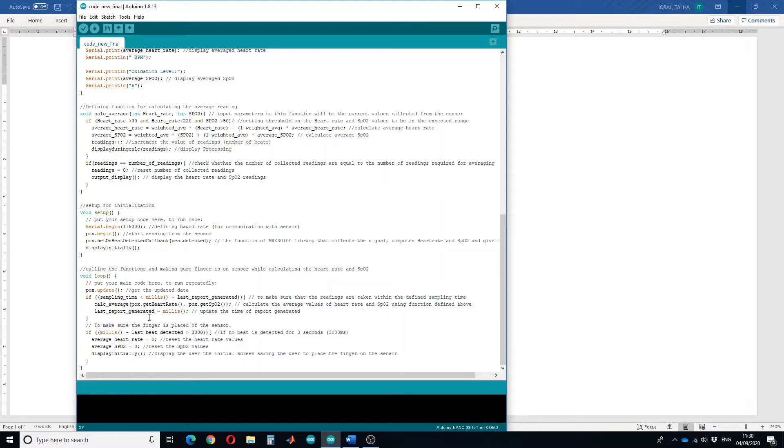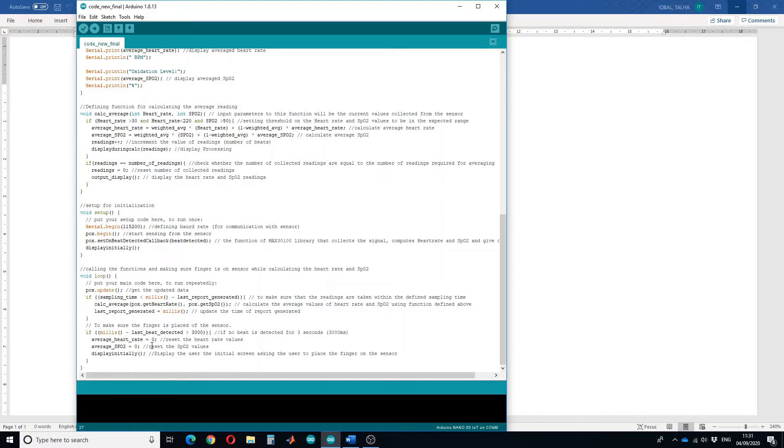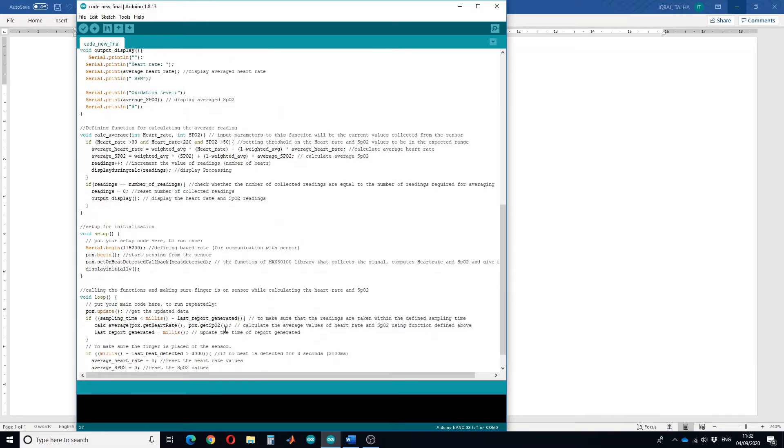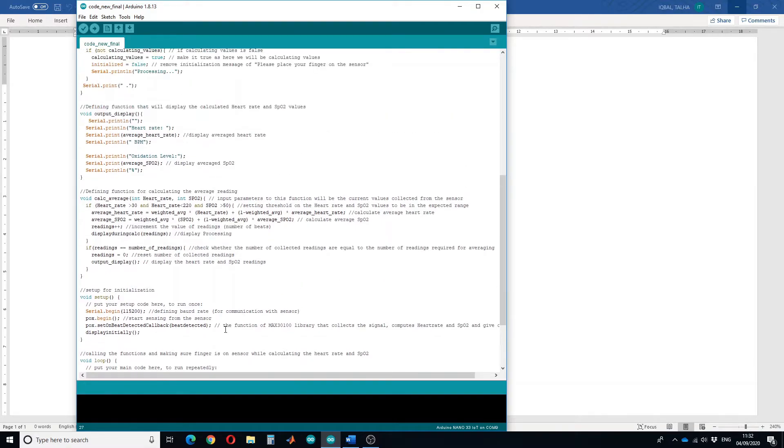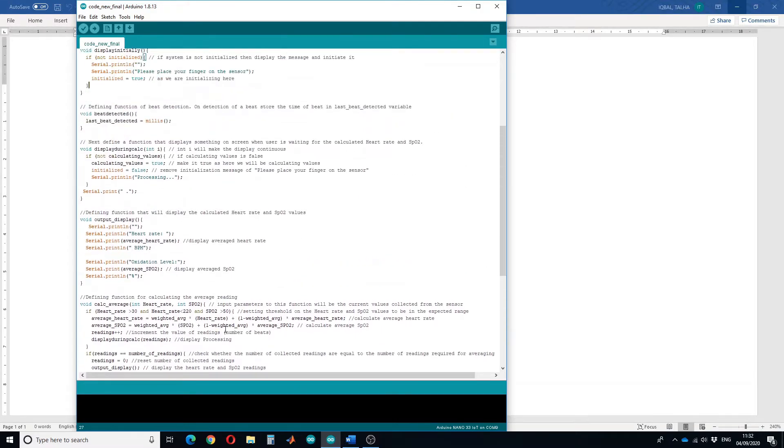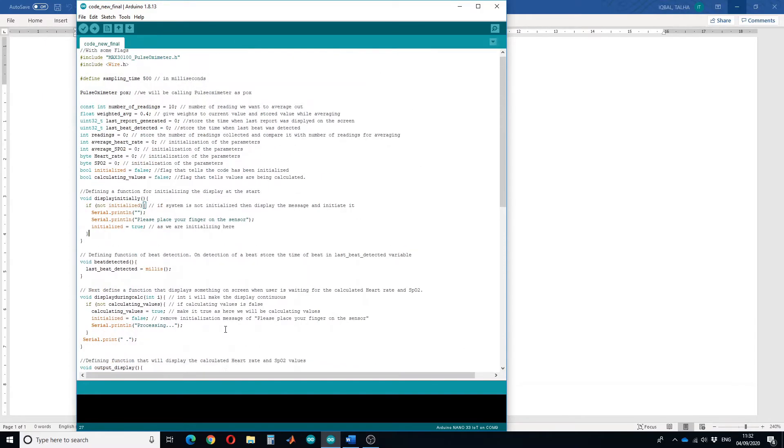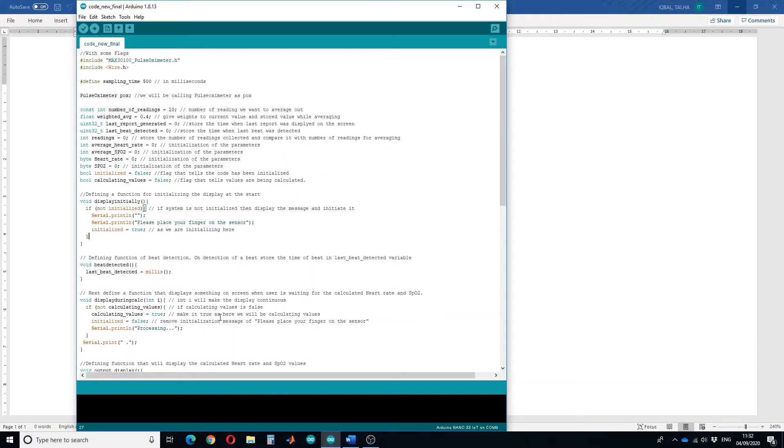To make sure that the finger is placed on the sensor, if there is no beat detected for three seconds, reset the average heart rate and SPO2 and again display the screen asking the user to place the finger on the sensor. This is my code for detecting the heart rate with a stable output.